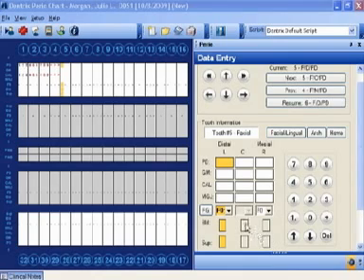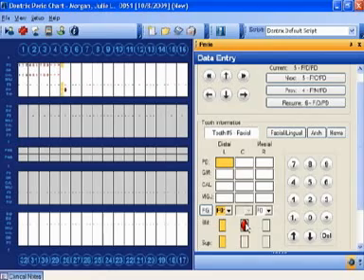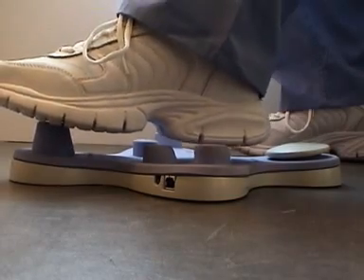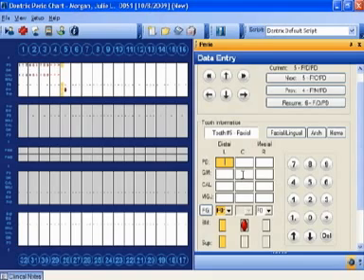That's what I usually recommend, is just park your mouse on the bleeding point right here. And then anytime you rock back on your heel, it's going to mark bleeding. And that way, if you have recession, you just mouse up to your recession, up to that GM square. And then you would do the same thing. You would rock back on your heel when you had recession.